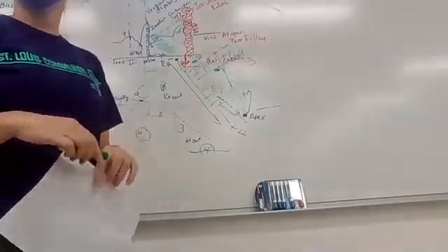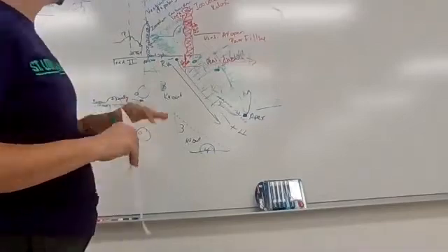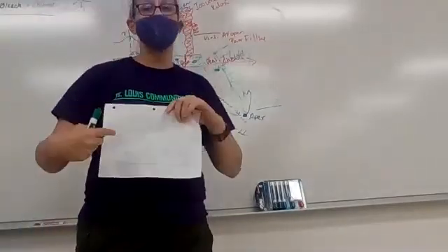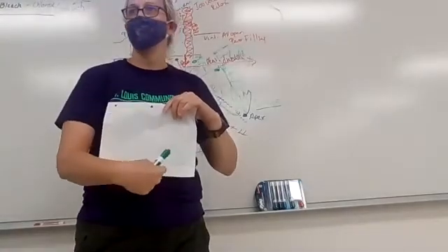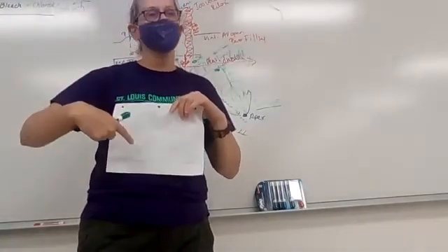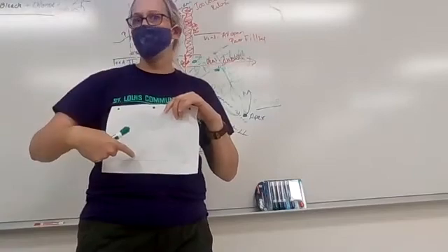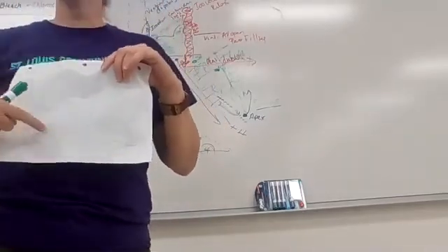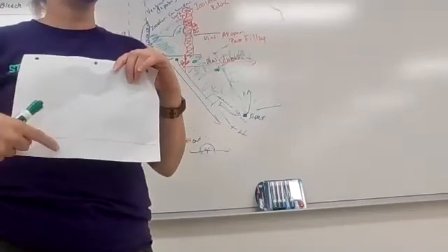Okay, so what you need to know, again, are what are the pieces, what are the main parts of the EKG? And so in your lab, there was that one picture. So expect that if I point to the front wave, that would be a P wave. If I asked you, what does it represent? That represents the atria depolarizing.